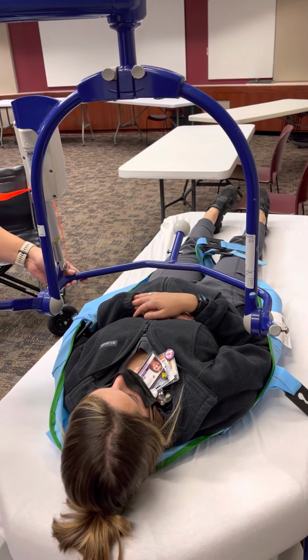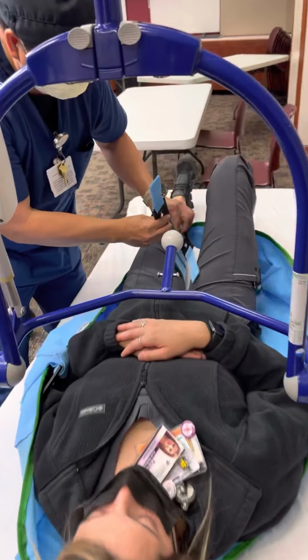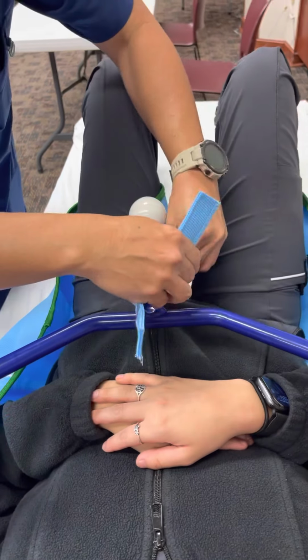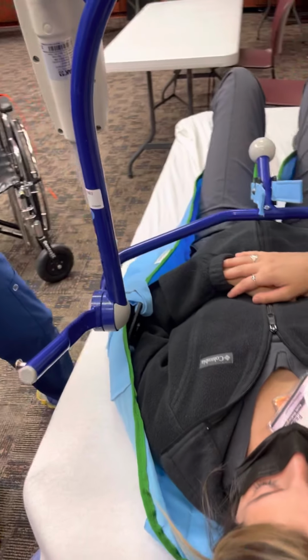and lower it towards her as close as possible. Then you ask the patient to bend their knees if they can, both of them, so I can put the strap right here. And that cradles the thighs. And I'm gonna lower it a tiny bit more.